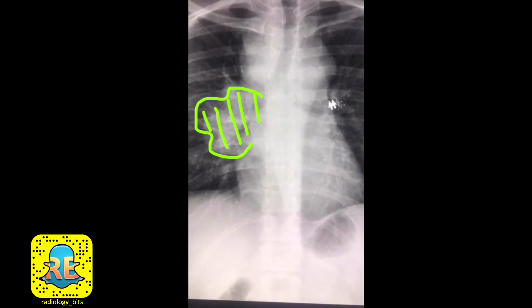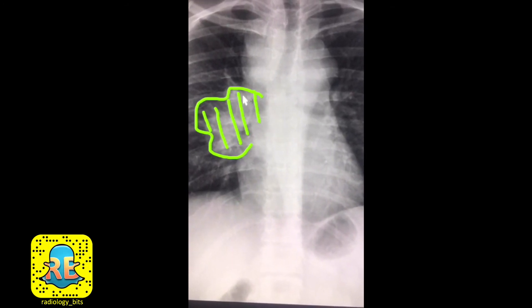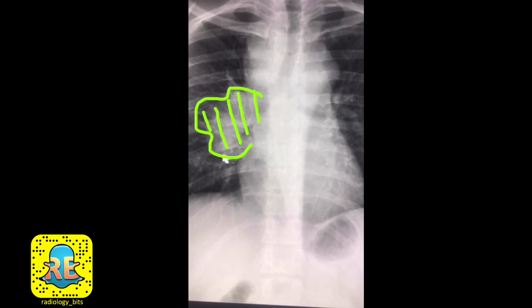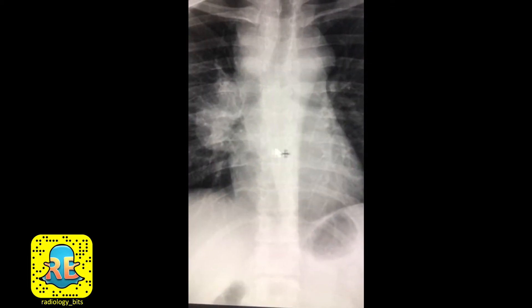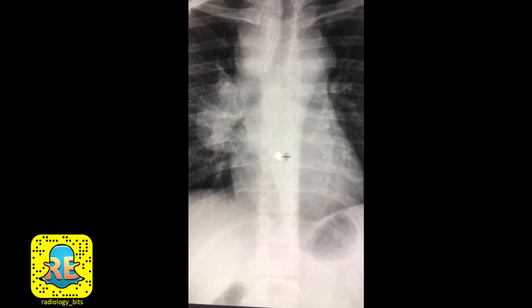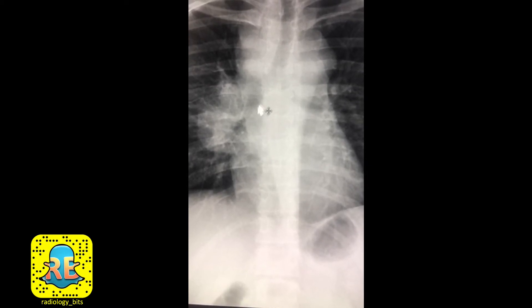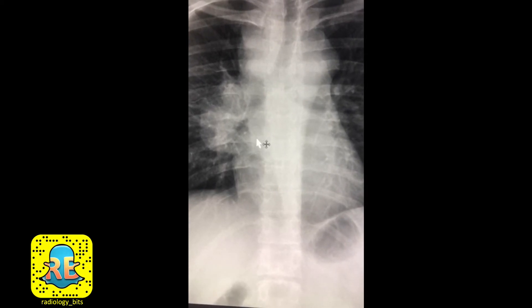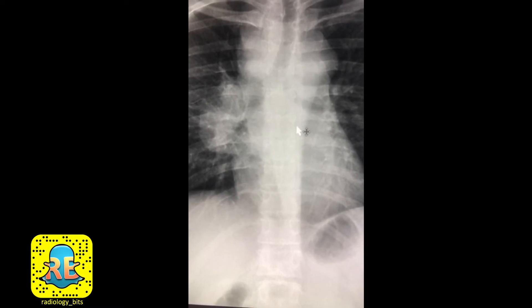Moving to the right hilum — compared to the left, you can tell it has increased size, increased density, and bulging contours. Now look at the third location, the infrahilar region. You would at least question increased density here, with a mass that might be bulging in this area, suggesting an abnormality in the subcarinal region as well.